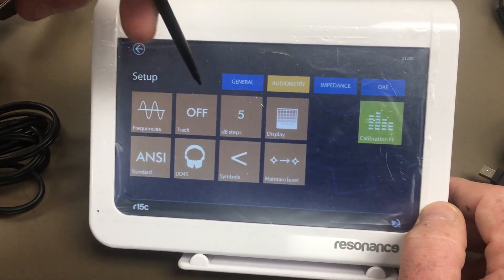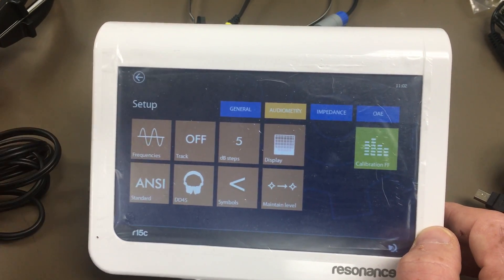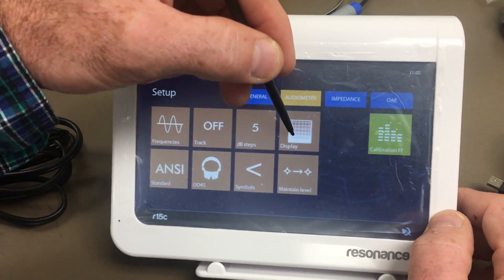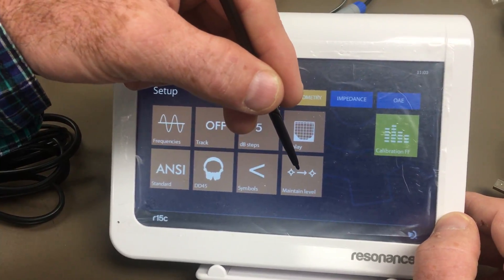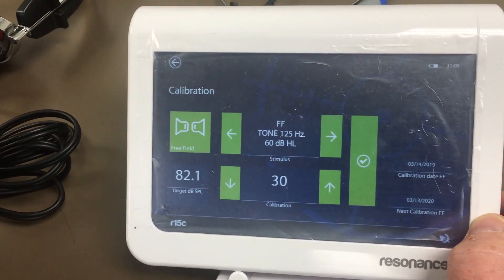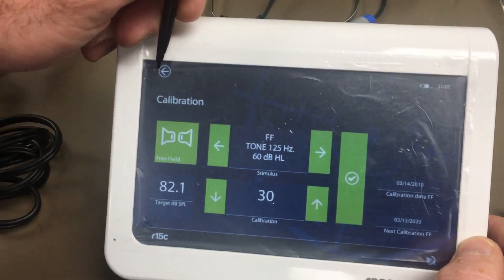We'll turn all frequencies on and press OK. Tracking is for when you move up and down in dB — it triggers masking automatically, but we're not going to use that. Your dB step options are 1, 2, and 5. You can also change the way the display looks and maintain the level. The calibration option here is for free field, which uses speakers and an external amplifier, but most of the time if you're out in the field you won't be using free field.